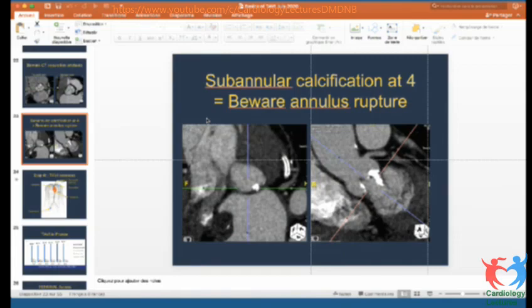Excellent. There is one more question. What was the hemodynamic monitoring point you were saying about during AR? How do you quantify AR? You already mentioned that in the slide. When do you decide to fix a paravalvular leak and when not to fix a paravalvular leak? I think Dr. Vivek wanted to know it again.